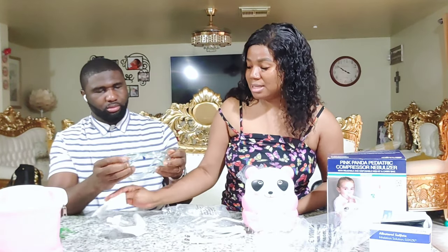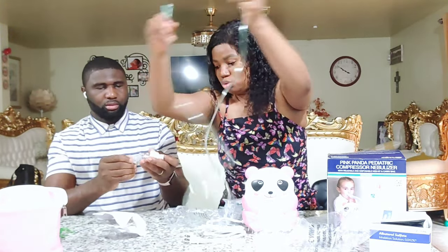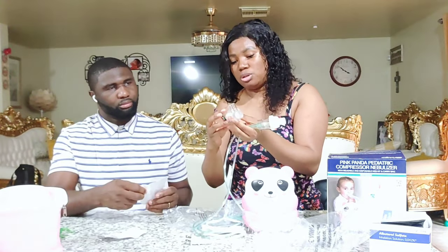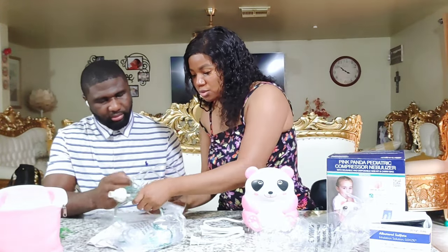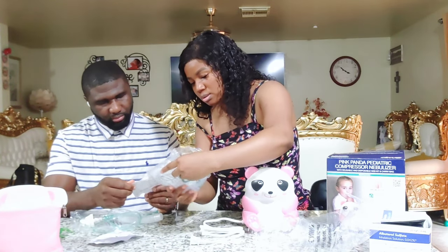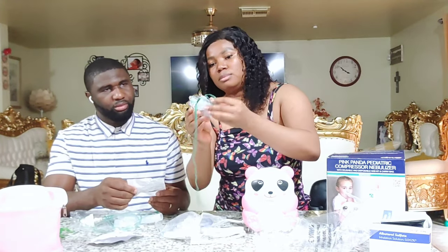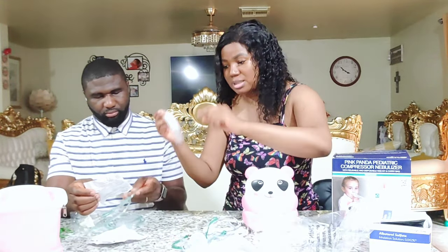You guys, remember, don't sterilize your pads because it might not fit back in. This is the oxygen tube. I need to show how it's used. This one is if they were doing it with the mouth, and the socket is for that one, right? This is it. I don't want to mix them both. That one has the mask, and that's the mask for the baby. This comes with the mask, so you put it around. We're gonna figure out what all this is, and this comes with its own tubing for the mask. So I guess that can be separate because this is the mouthpiece for that one.